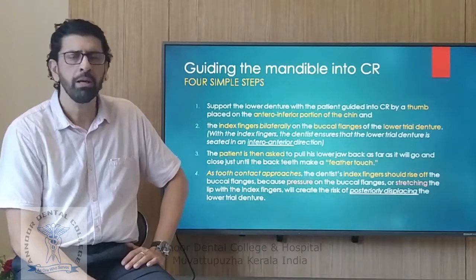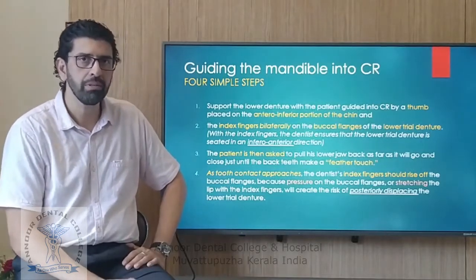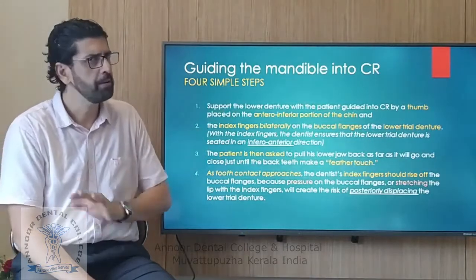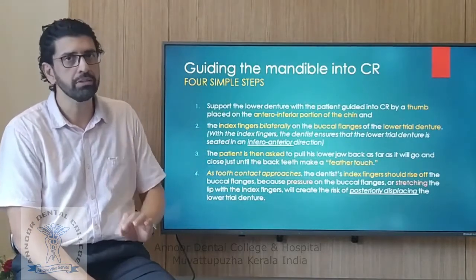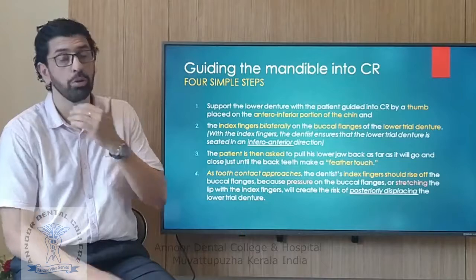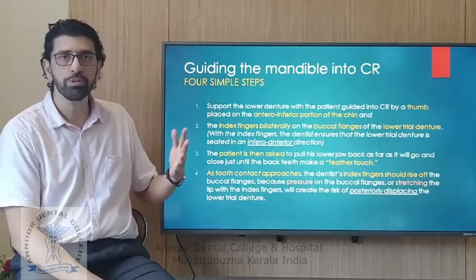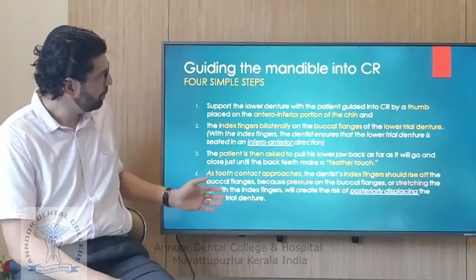Now, before we get into this, let me tell you how to guide the mandible into centric relation. Very important. You need to get this straight, because if you don't, it's going to be difficult all over. So how do you guide this? I put four simple steps: 1, 2, 3, 4 there.